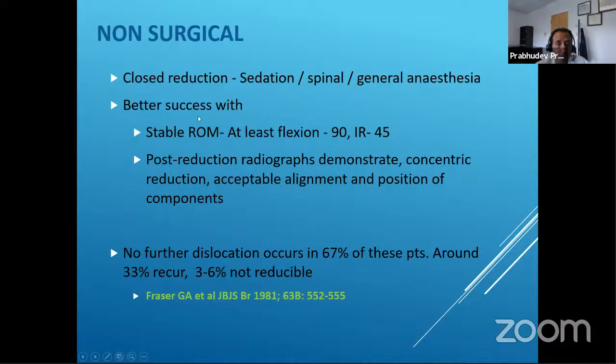They should be evaluated dynamically under fluoroscopy after the hip is reduced. And post-reduction X-rays should demonstrate concentric reduction, and the alignment is acceptable, and the position of the component is acceptable.